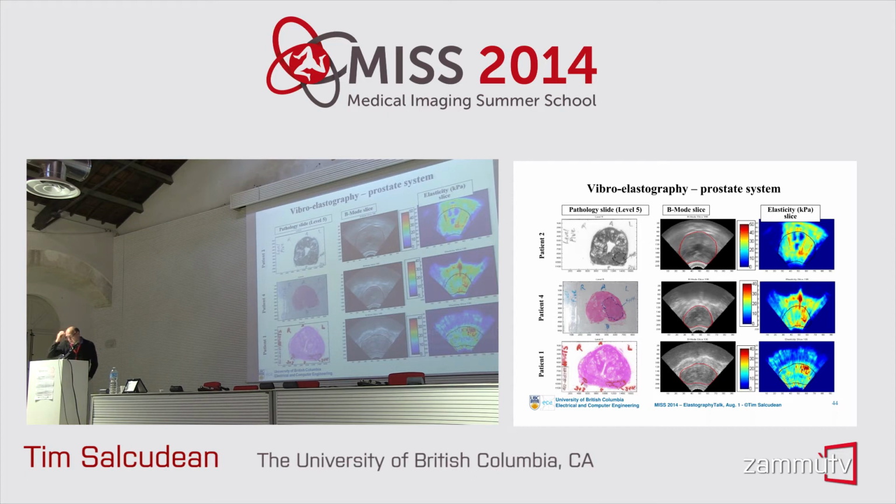We have now a few papers out that actually look at the correlation between stiffness and cancer. Prostate is fairly difficult to handle. If you use a multi-parametric approach, we can get decent AUCs of around 0.82. But I have here two instances in which you have much stiffer regions that do correspond to cancer.